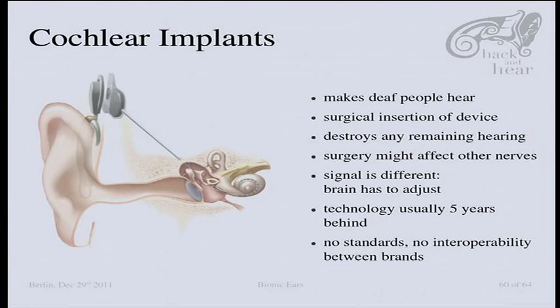And cochlear implants are what I find really fascinating. I mean, they really make deaf people hear. It's only applied to people who have a really severe hearing loss, like less than 20% or something. So they hear only less than 20%. Of course, it's a surgery to insert that.